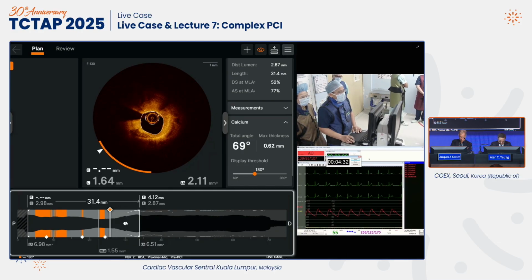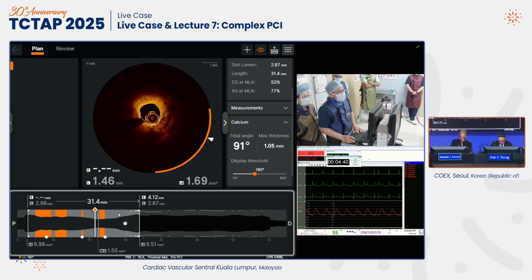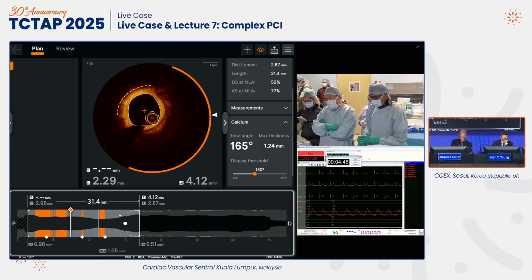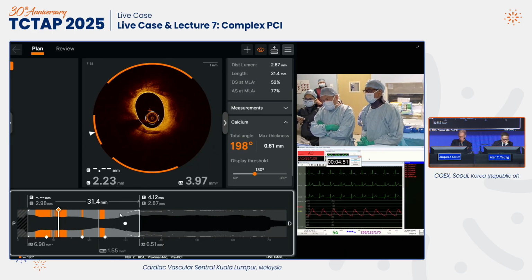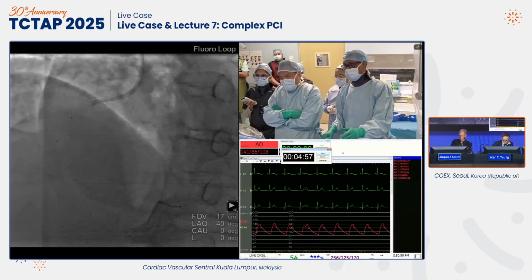There'll be some minute cracks here, maybe some small little speckles of calcium. But it's essentially not much being done to the calcium as I go back up straight to the proximal here. So proving that we did not really crack the calcium with the balloon, we can show the advancement of a 3.5 millimeter Lithics balloon. At the moment, we do not have 4 millimeter, we have 3 millimeters.